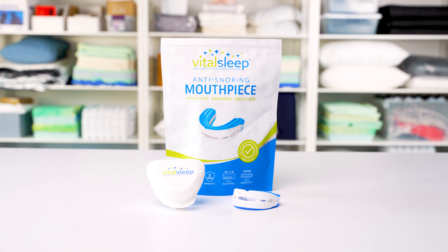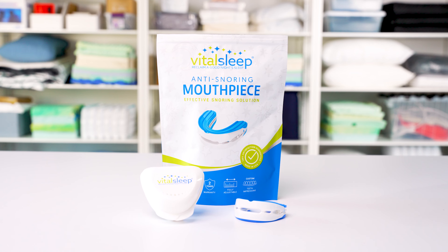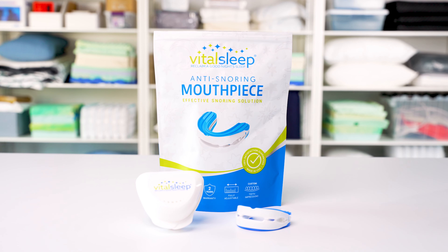Hey everyone, I'm Tom from Sleep Foundation, and today in our test lab we have an anti-snoring mouthpiece made by VitalSleep. In this video, we'll talk a little bit about what this mouthpiece can do for you, how it works, and why we recommend it. Let's get into it.